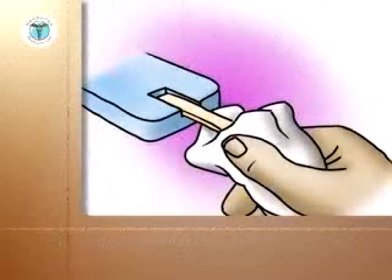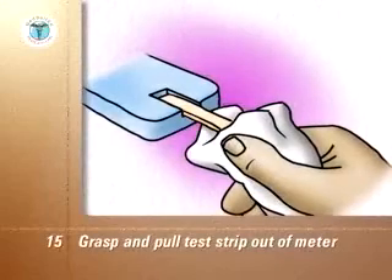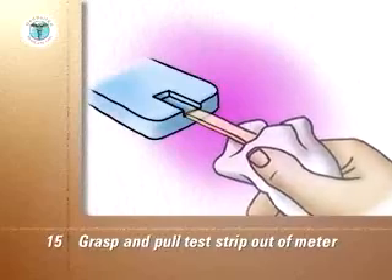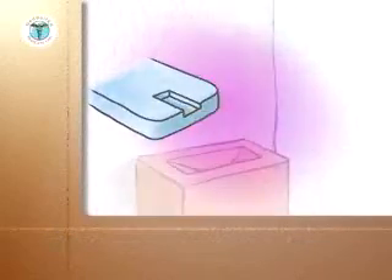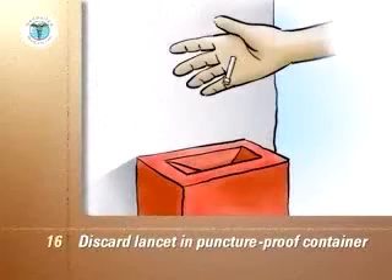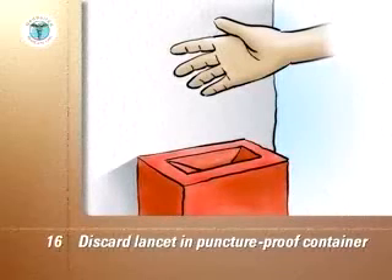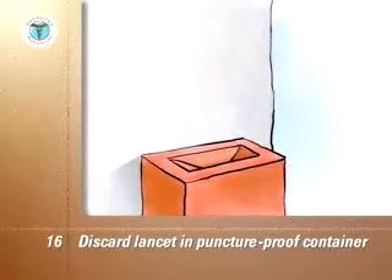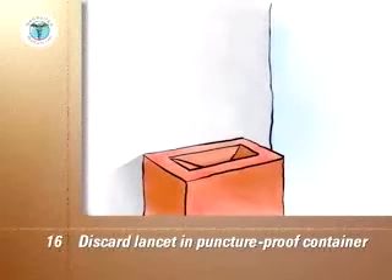Once the blood sugar reading on the meter is complete, use the tissue to grasp the test strip and pull it out of the meter. This usually turns the meter off. Discard the lancet in its protective cover and the used strip into a glass or puncture-proof container with a screw top, or a sharps container purchased from your local pharmacy. Replace the cap on the container. When the container is full, cap it and discard it into the trash.